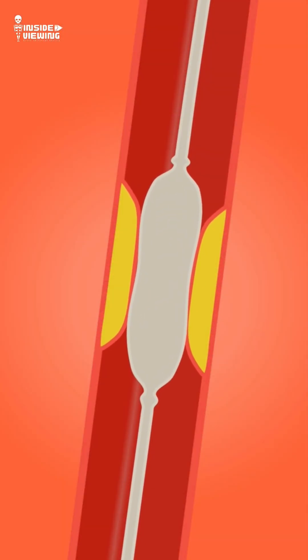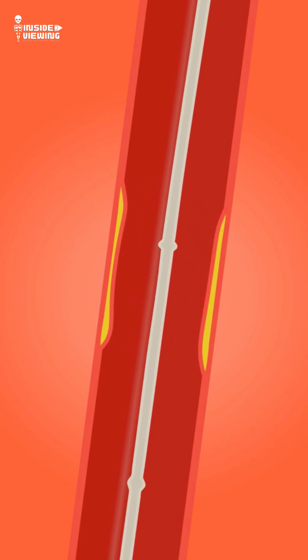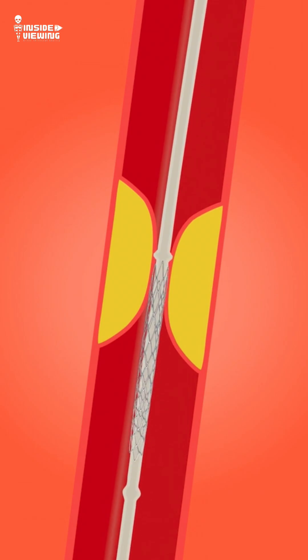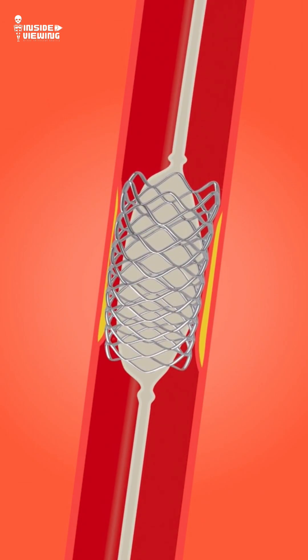At the blockage, the balloon is inflated, pressing the plaque against the artery wall and reopening the vessel. In most cases, a stent is placed to keep the artery open long term. The balloon is removed — the stent stays.